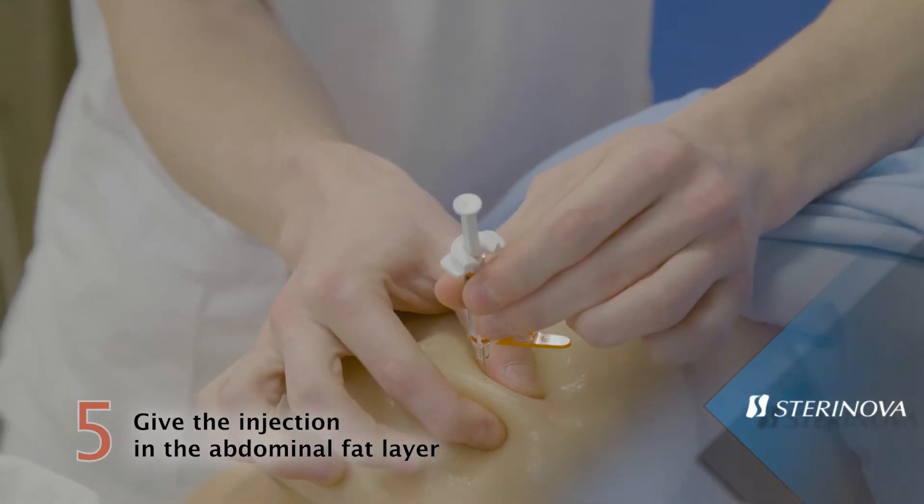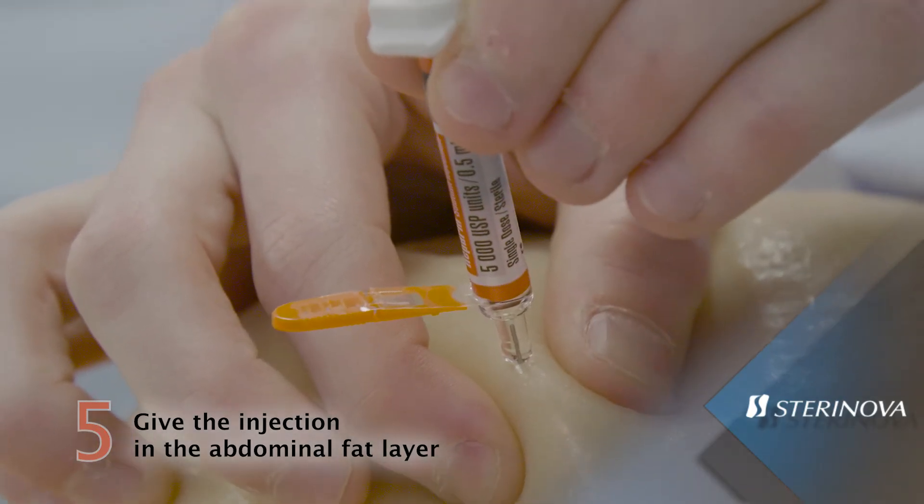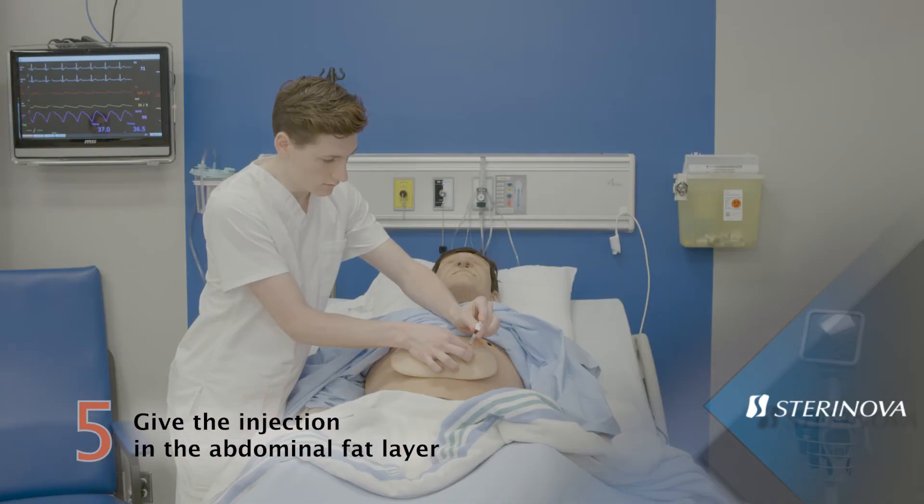Insert the needle at 90 degrees perpendicularly to the skin fold. Inject the product slowly during 15 to 30 seconds.